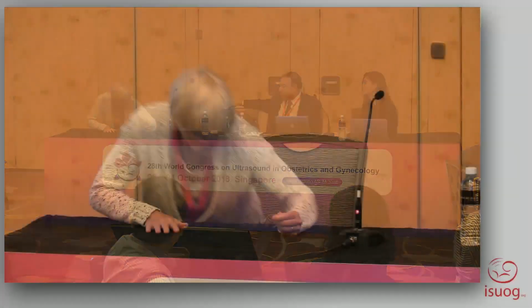Well, concerning the safety, it said only when clinically indicated. So if you have a large nuchal translucency and you think it's clinically indicated to look at the ductus venosus, yes, indeed, you could look at it, but try to be efficient and not do it for very long. That's what it's trying to say. Don't use it for just looking at the heartbeat or something like that, or just to look at the umbilical cord. But if there is a clinical indication, even at 11.5 weeks during a first trimester screening scan, then you can use it.